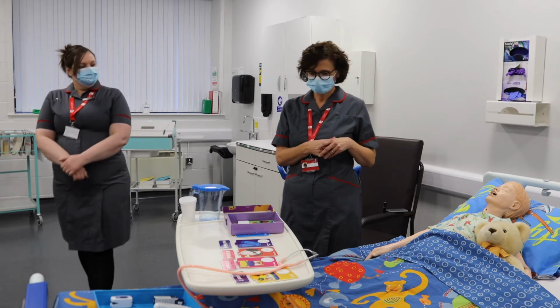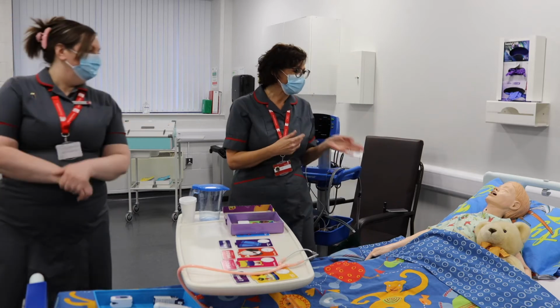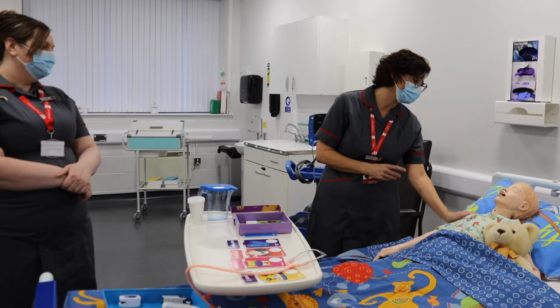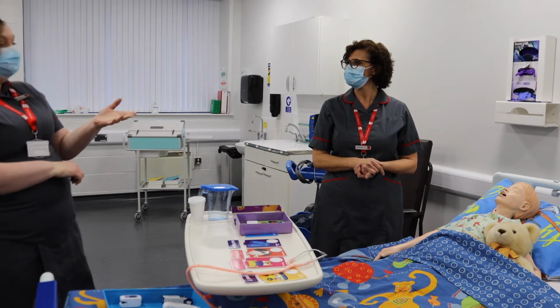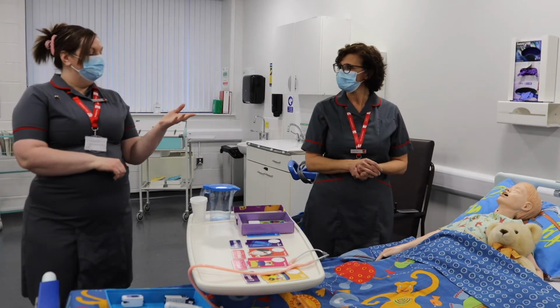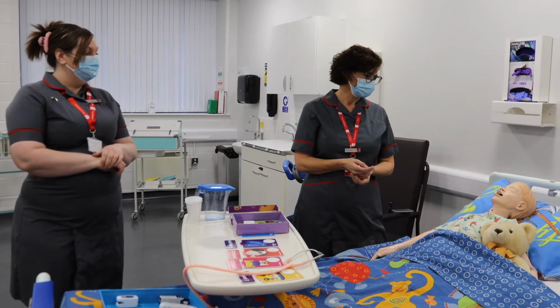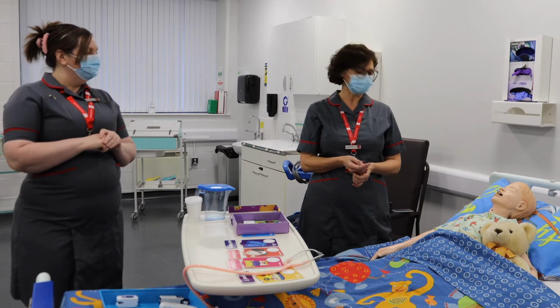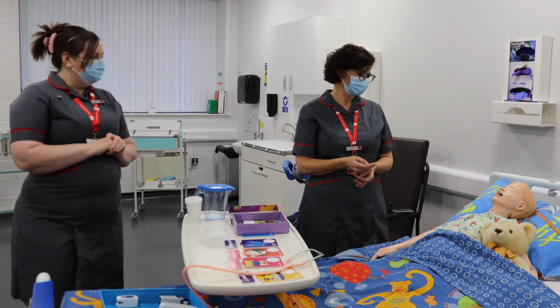Of course, yeah. So have you met Sam before then? I haven't. I've seen him from afar, but hello Sam, my name's Lorraine. I'm going to be your nurse today. So Sam is one of our Sim Junior mannequins and he is roughly about 7 or 8 years old. So why don't we do some observations on Sam?